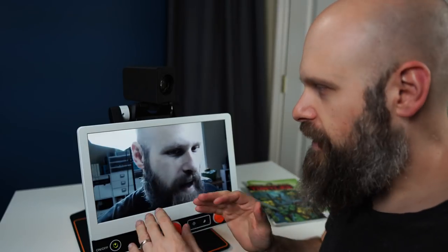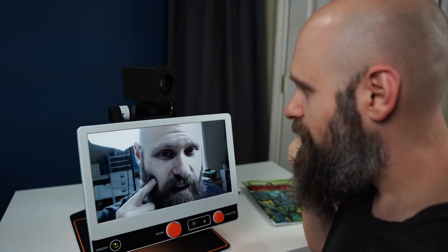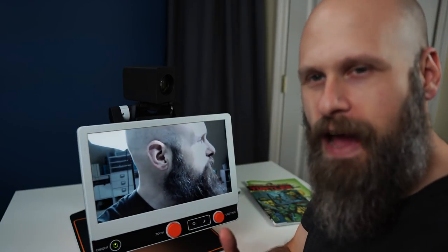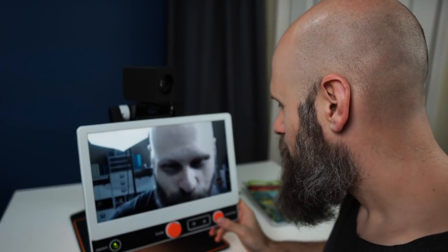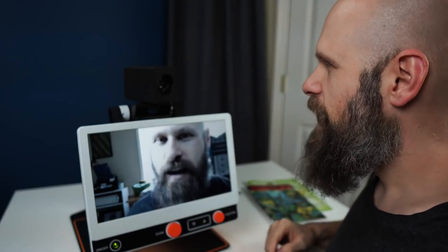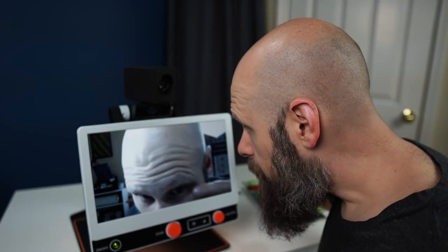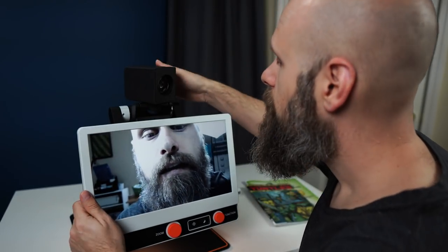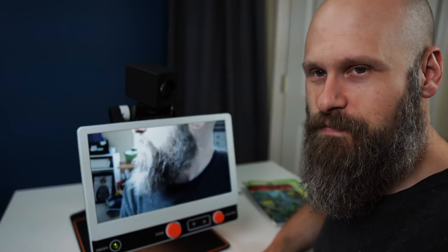You remember I mentioned the mirror mode in the settings — well, that's for distance viewing. If I reach up and touch my right cheek, the picture on the screen shows me touching my left cheek. You can imagine if you were trying to put on makeup that could be very difficult. So we just go into mirror mode and click that. Now if I touch my right cheek, on the screen I'm also touching my right cheek — which is going to make it much easier for putting on makeup or trimming your beard.